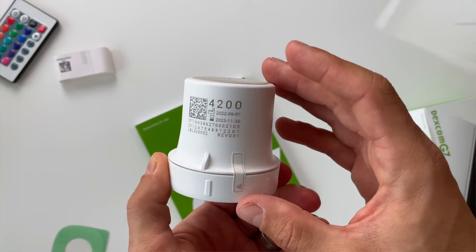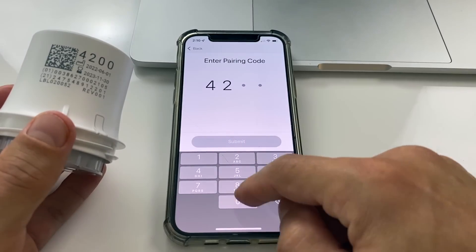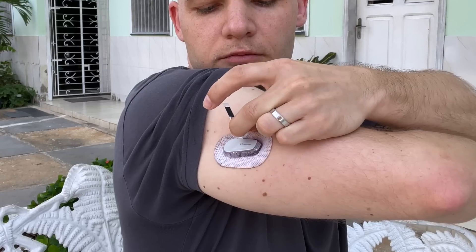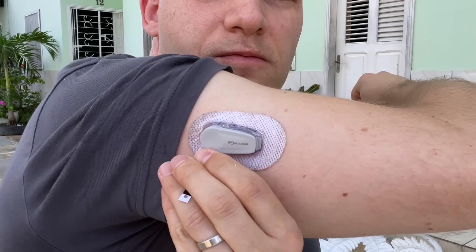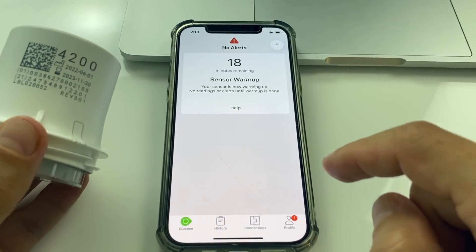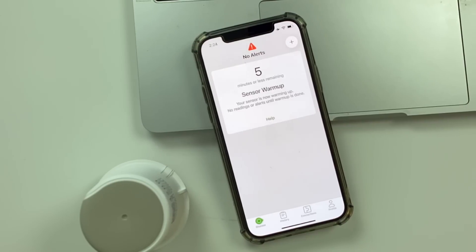It is now much faster and easier to put the sensor on, but the all-in-one system probably also means you will not be able to restart the sensor and extend its lifetime in an emergency. Another new feature of the G7 is the automated sensor warm-up. On paper the warm-up is 30 minutes, but in real life you won't have to wait the full 30 minutes to get your first blood glucose reading after applying the sensor.